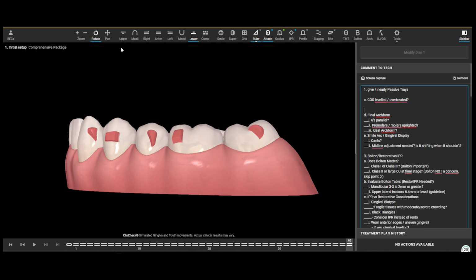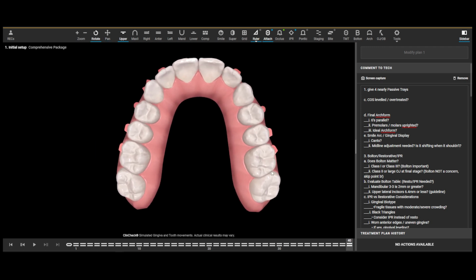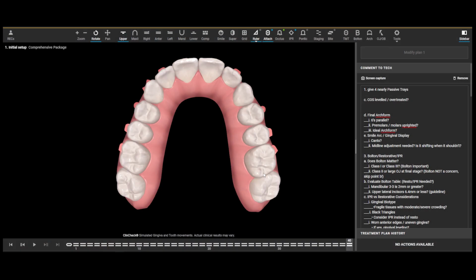Okay, so what's next? Final arch form. Again, I'm starting off by going through this checklist, and I'm just making notes of anything that needs to be adjusted or modified. And then once I click the modify button, that's when I can go in and actually start making changes to this plan manually. But to start with right now, I'm just going through line by line until I get to that time that I'm going to make those changes myself.